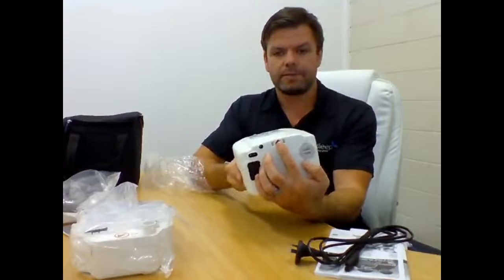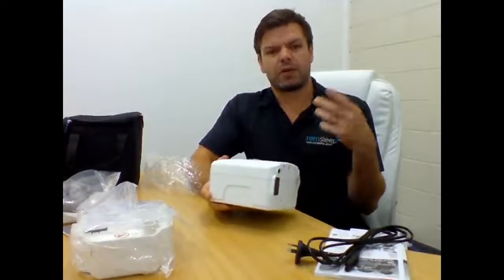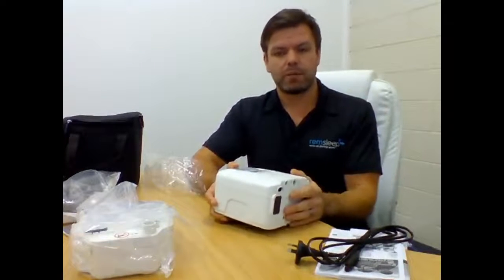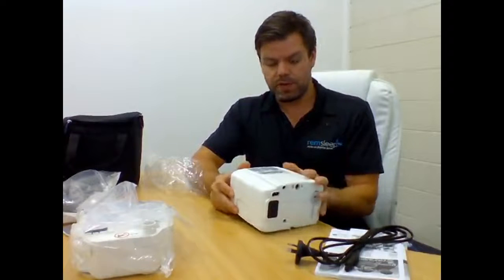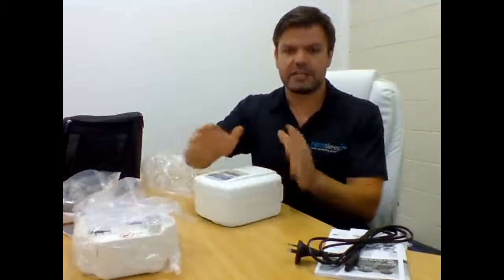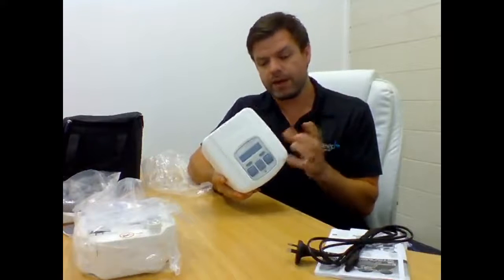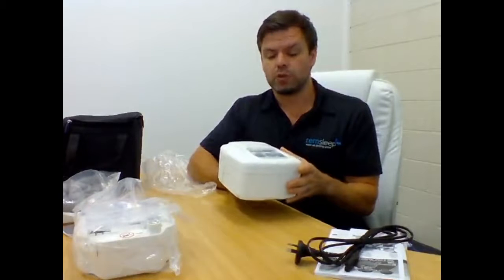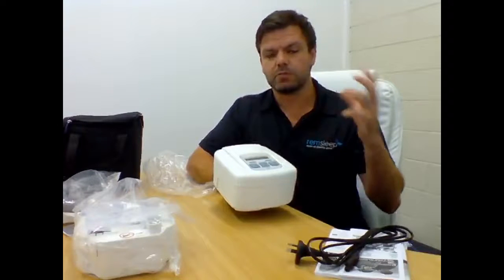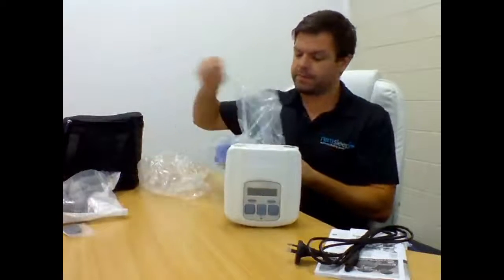There is another port up here, and that's if you want to add a smart module to the machine. By doing that, you can add oximetry, so if you want to look at your blood oxygen levels, you can wear an oximeter. It also has an SD card for the smart module, so you can transfer data. The data is a bit more advanced if you get that smart module pack, and they're between $100 and $150. But the machine does have a hard drive in it which stores data anyway in the smart code format. So you don't need to get that module if you want to look at data, because you can look at the data on the screen and using the smart code application, which I'll talk about a bit later. So this is your machine, and I'll just get the humidifier out of the pack.